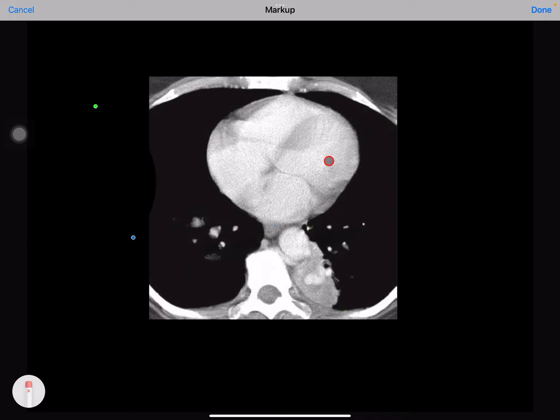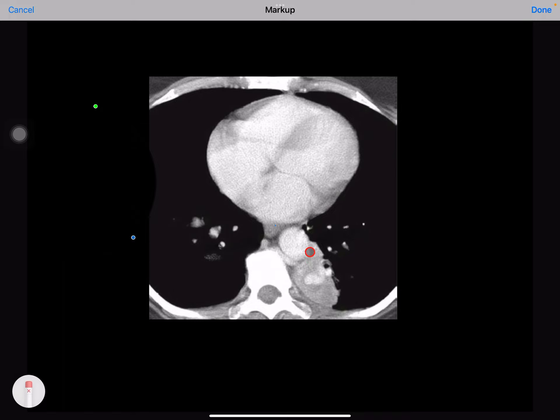This is the contrast enhanced CT scan study of the chest, in the mediastinal window. You can see a soft tissue density mass lesion that is posterior to the descending aorta. Multiple blood vessels are appreciated in this mass lesion, and you can see arteries arising from the descending aorta.